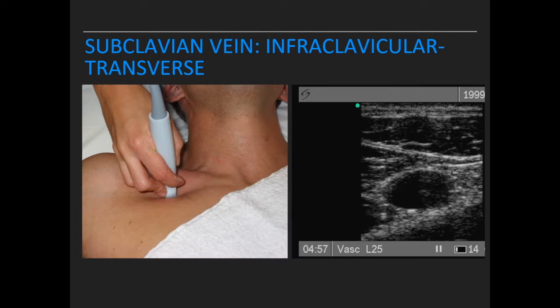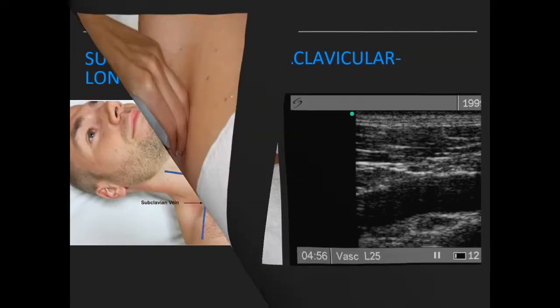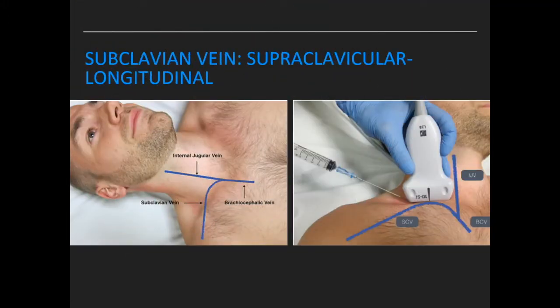The subclavian vein can be approached either infraclavicular or supraclavicular. In the infraclavicular approach, the probe is placed inferior to the clavicle at the mid-clavicular region. In the supraclavicular approach, the vessel sits just beneath the clavicle and is relatively superficial — less than one centimeter — making it easier to cannulate. However, due to its close proximity to the pleura and difficulty to compress, this vessel is less favorable.